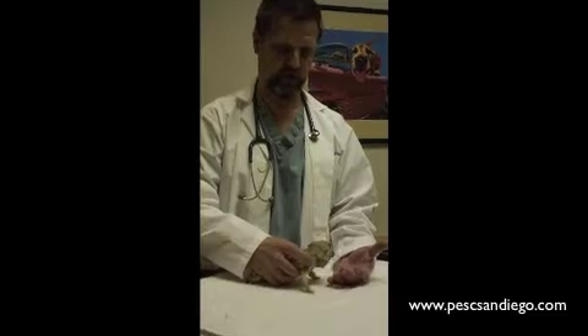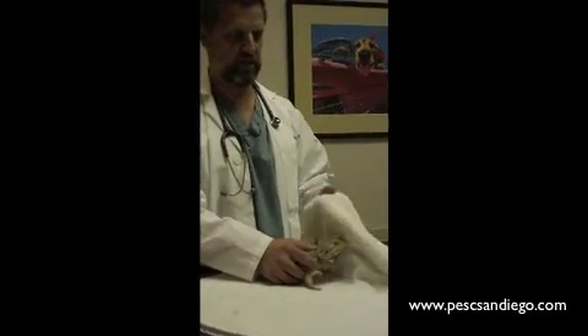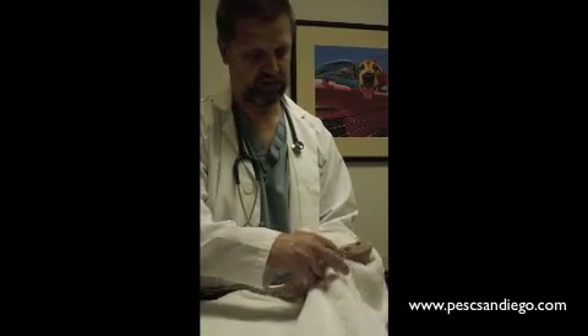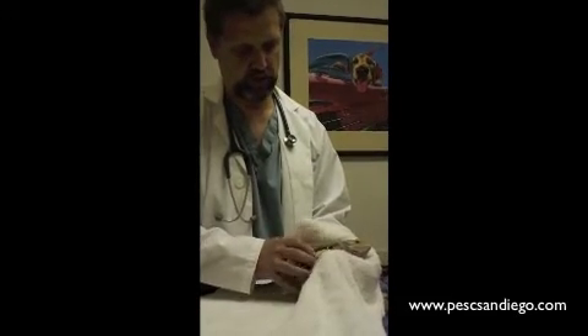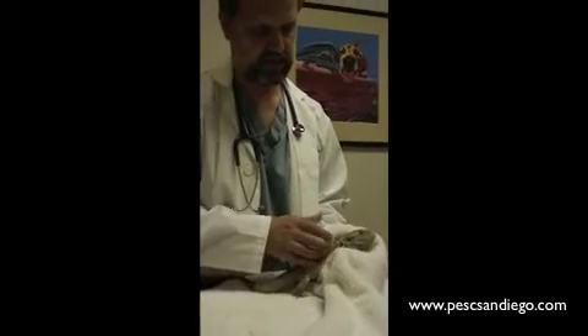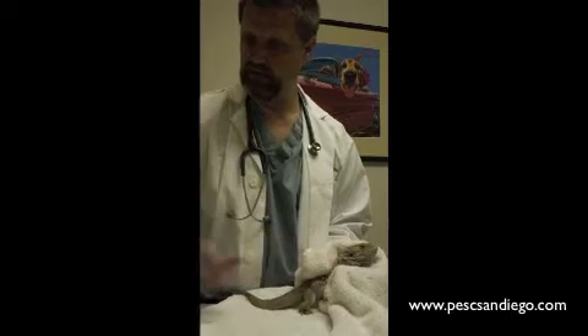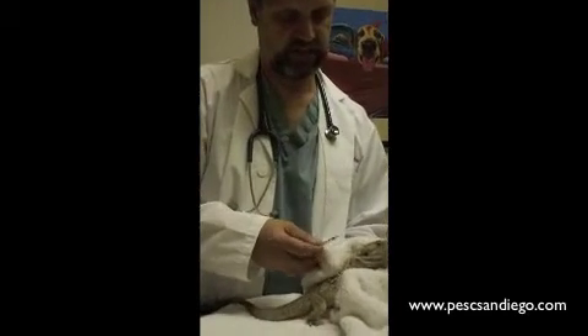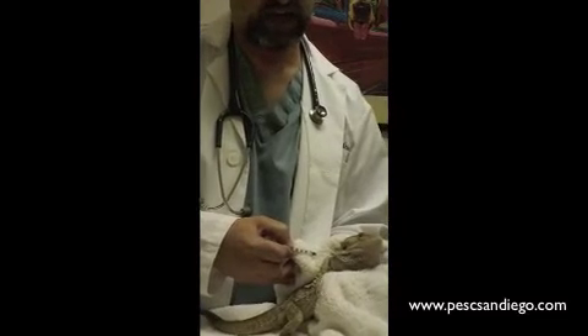So this is a bearded dragon, and they're not going to want to stand still for this. So we're going to want to restrain them lightly in a towel. What I like to do is kind of cover half their body, and then I'm going to pull this front leg backwards. We always want to give the intramuscular injections in the front limbs of the body. We're going to expose this back deltoid muscle. We're going to insert the needle towards the head underneath the scale.